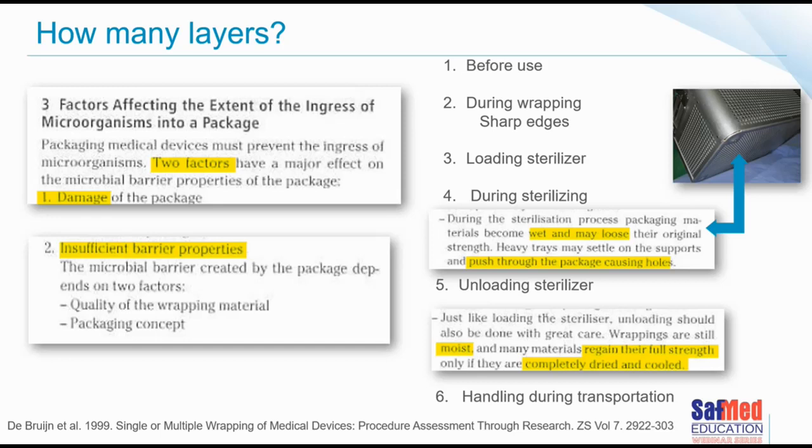So they'll make their bed or their trolley or their feeding trolley that they work off, and they'll do a set, and then they'll do the next set, and then they'll pile the third set on top of that, the fourth set on top of that, the fifth set on top of it, so that at the end of the day, you get 6-8 sets with a really huge amount of weight on them before it's even gone into the sterilizer. Then, of course, loading into the sterilizer, how we handle the package whilst we're loading it and how we load it in the sterilizer.